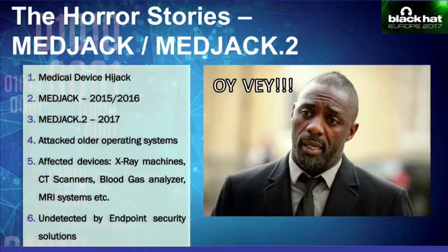Interestingly, MedJack only targeted older operating systems. Right? So it didn't go for new operating systems. It only went after older operating systems like Windows XP, Windows 2000, Windows 2003, etc. It also specifically tried to exploit older vulnerabilities, like MS08-067, which was released in 2008.